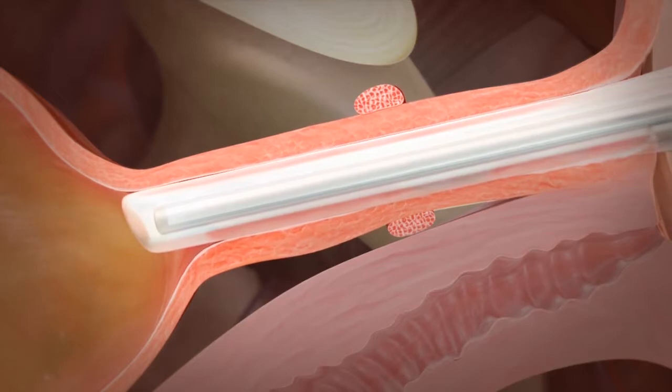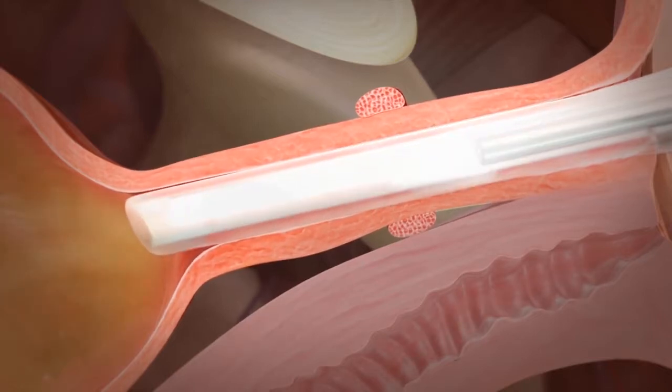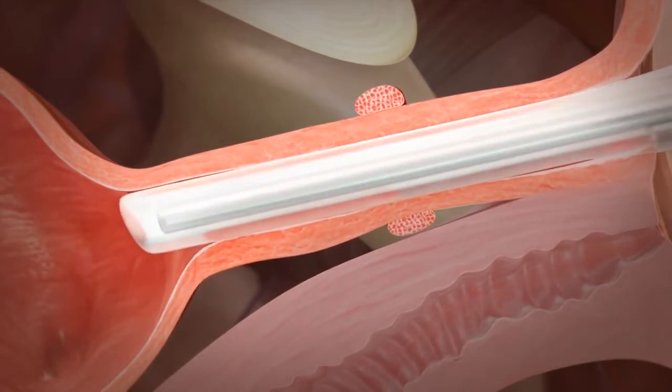A local anaesthetic gel may be applied to the rotatable sheath to act as a lubricant and to provide additional patient comfort during the procedure. If the patient has not emptied their bladder prior to treatment, this can be done by retracting the optic from the rotatable sheath. Then, reassemble the Bulkamid system and advance it until the tip of the rotatable sheath is adjacent to the bladder neck. Adjust the camera so that the 12 o'clock position on the screen corresponds to the 12 o'clock position of the needle in the sheath.